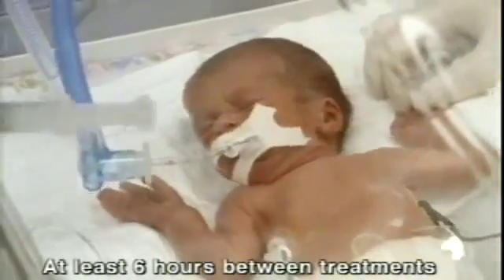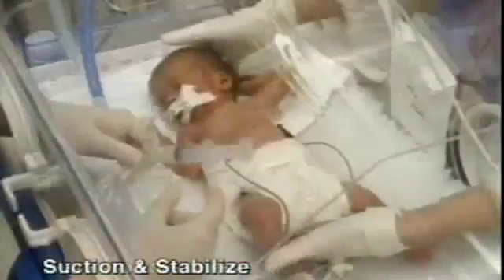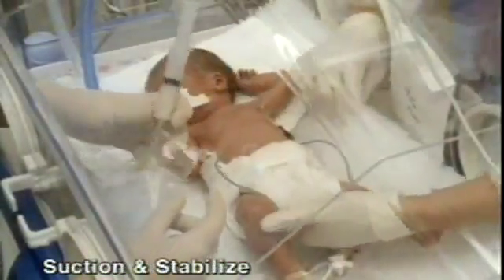Retreatment should occur only if the infant has RDS, remains intubated, and requires at least 30% inspired oxygen to maintain an arterial oxygenation of less than or equal to 80 torr. Retreatment with Surfactant is virtually identical to initial dosing. However, wait at least 6 hours between treatments. As always, be sure to warm the drug to room temperature for each treatment. And make sure the infant is suctioned and stable.